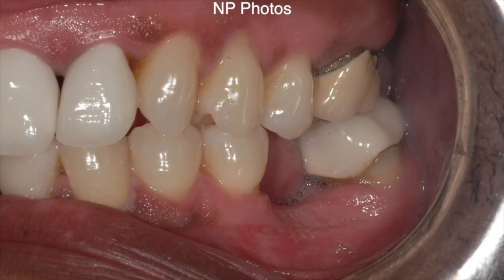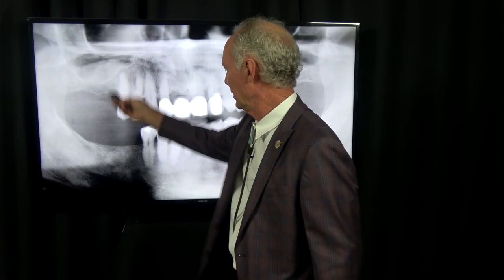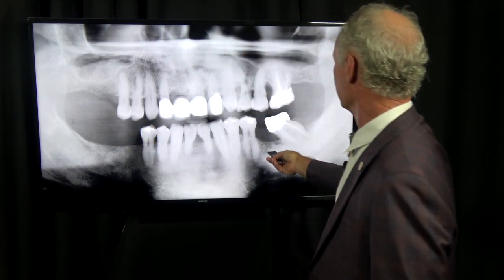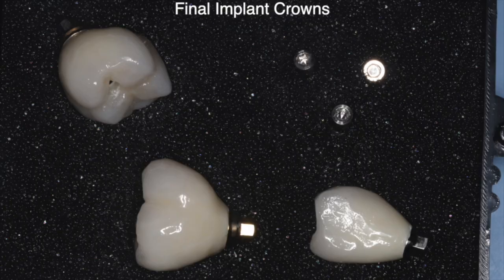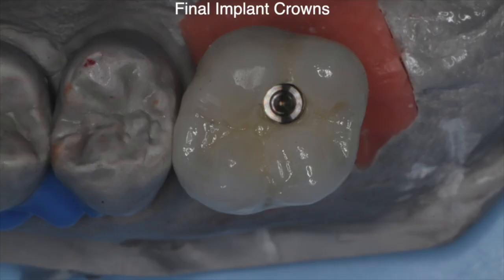These are the new patient photos. This is a pano before replacing an implant abutment crown here, here, and here — one, two, three — two on the mandible and one in the maxilla.